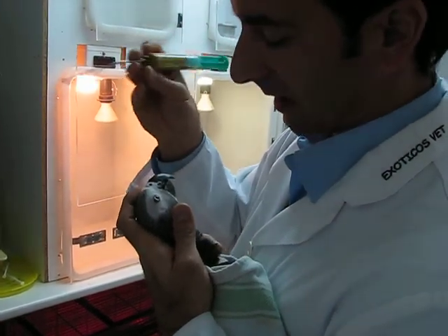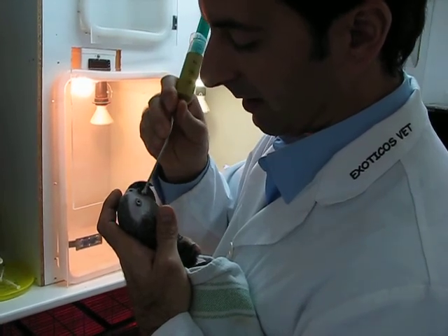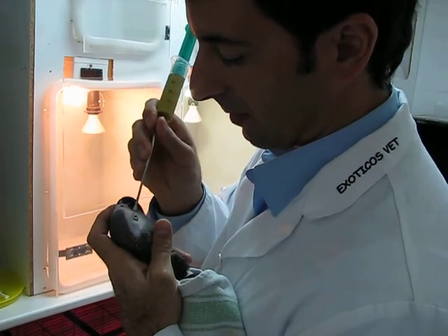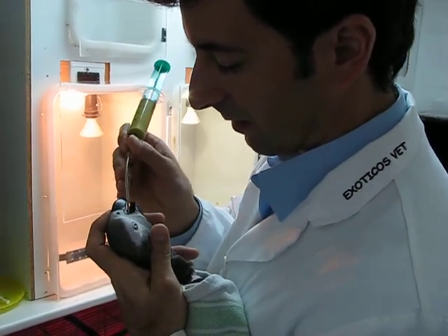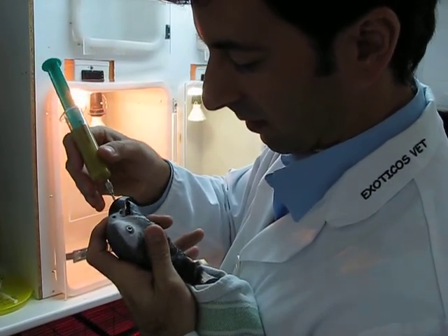This is a feeding cannula. You put it in the mouth of the parrot — sometimes they don't want to open. You push here at the edge and then they open the beak. What you do is you have to go down the throat slowly, down to the crop.